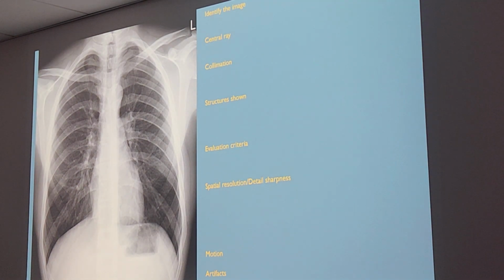First of all, with chest X-rays, if it's not portable, we can safely assume it was done PA. Also, you see the marker up here? It says left, as though the patient is looking at you right now. So we know his left side is over here and right side is over here. Not only that, look at how the heart is turned to the left, correct?